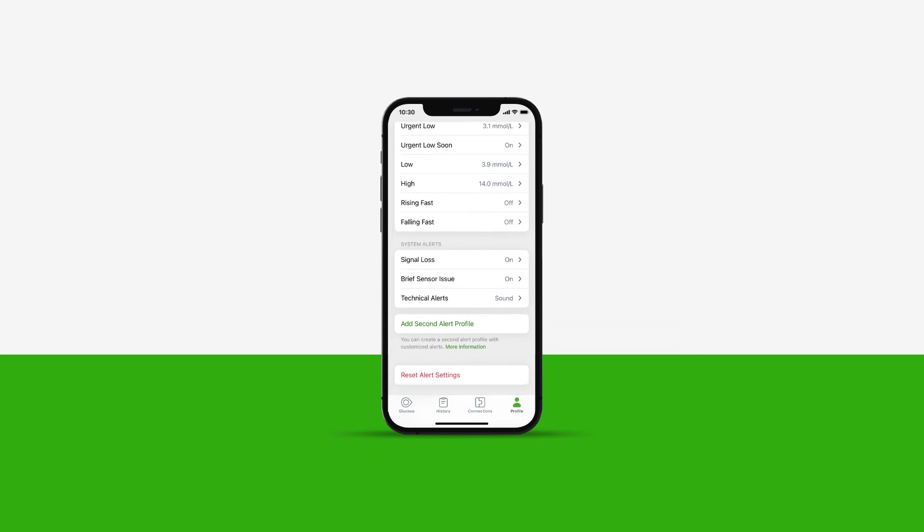Below glucose alerts, you will notice there are three system alerts. These alerts can also be customized.